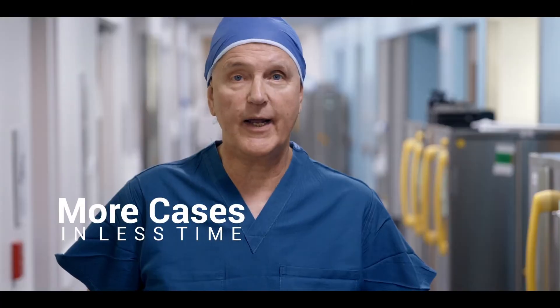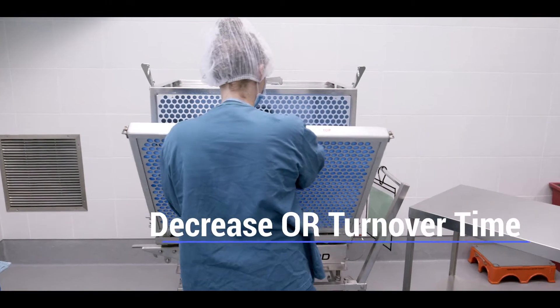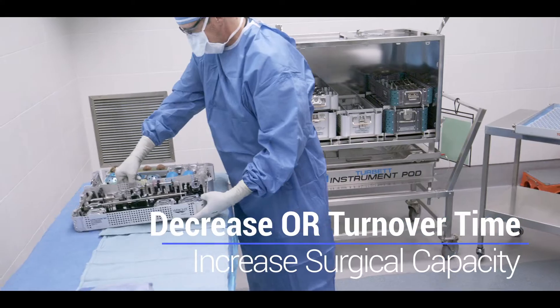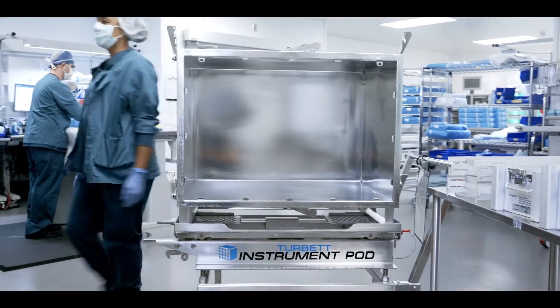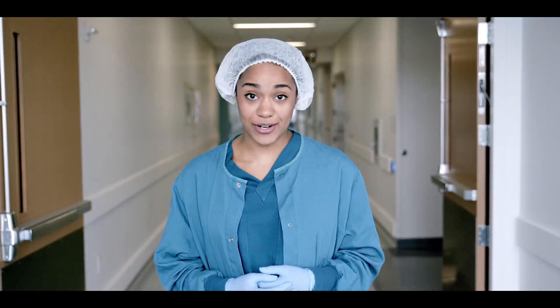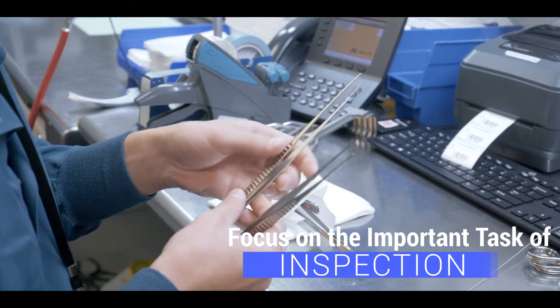By using the Turbett pod and getting one more total joint done for surgical day and leaving 45 minutes earlier. Despite this increased production, the acceptable occurrence of bio burden is zero. The instrument pod lets you focus on the inspection of the instruments.